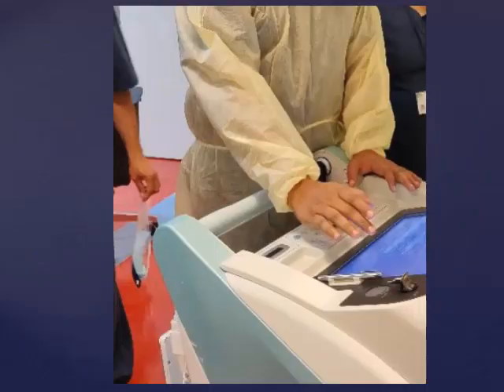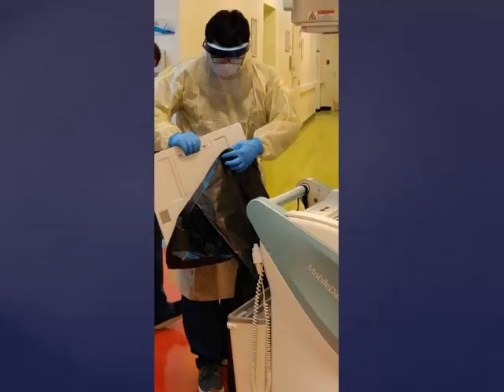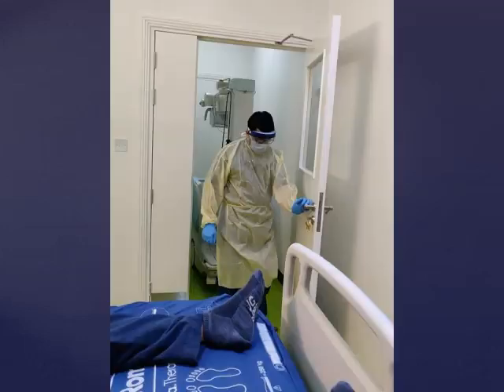Once you're on the ward, make sure you enter the patient details in the portable x-ray machine before you enter the patient's room. Gown up, then cover the detector with the plastic sleeve — in this case we have used a black bin bag — and place the detector back into the portable machine. Enter the anteroom and, through the anteroom window, make sure there is enough space in the patient's room for maneuvering the portable x-ray machine. If there is not enough space, get extra help so that you're able to move the patient's bed quickly with support. Also make sure that the patient is masked before entering the room.